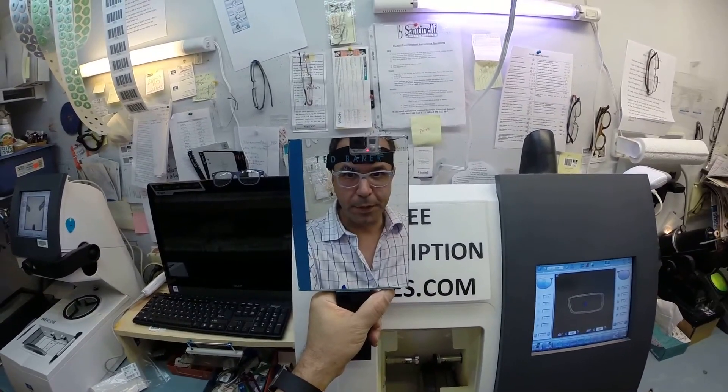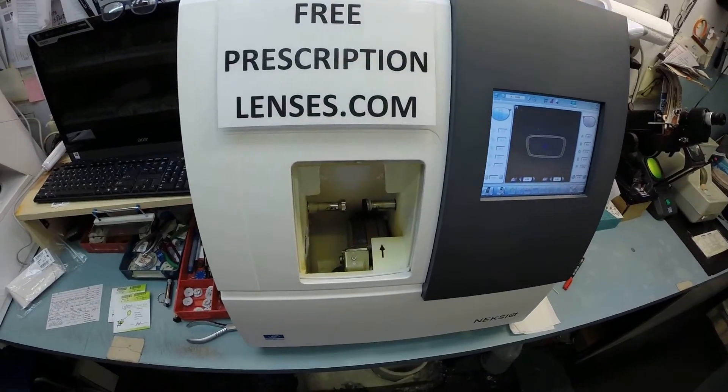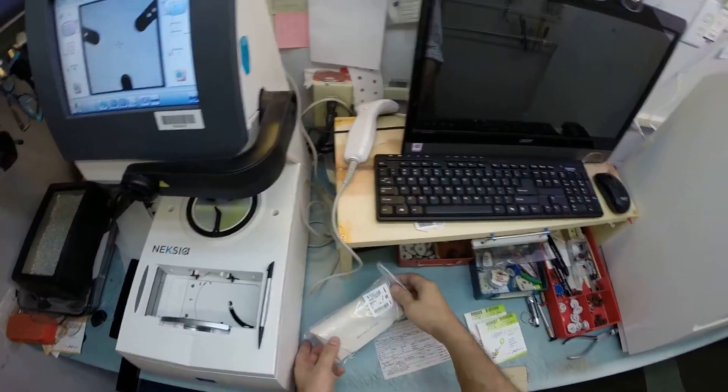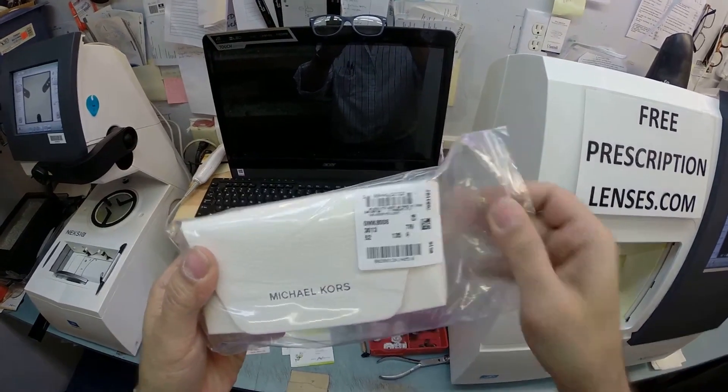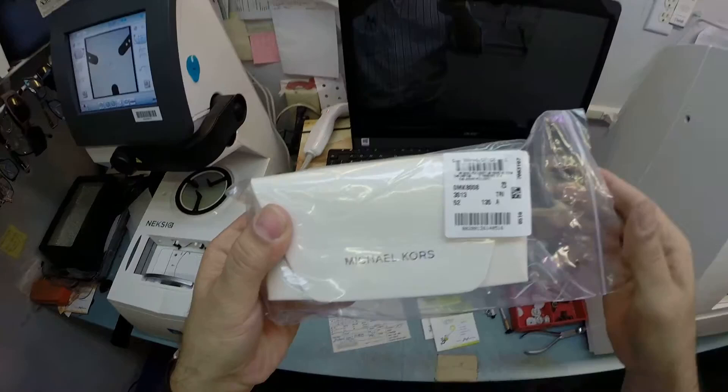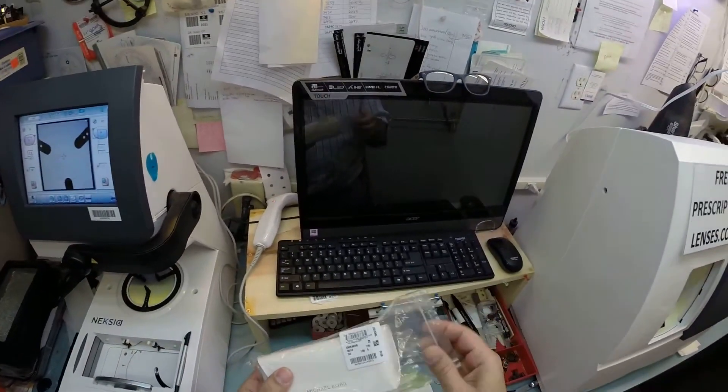Hey Mary in Greensboro, North Carolina. It's Matthew with FreePrescriptionLenses.com and with the help of my GoPro camera, I'm going to show you how I cut prescription lenses for your brand new Michael Kors 8008. The color is 3013 and the 52 eye size.